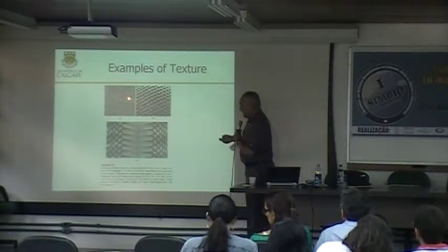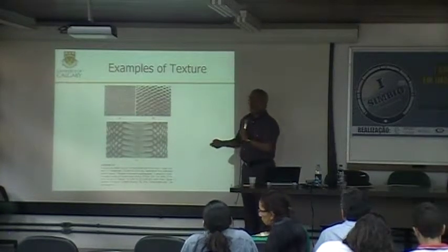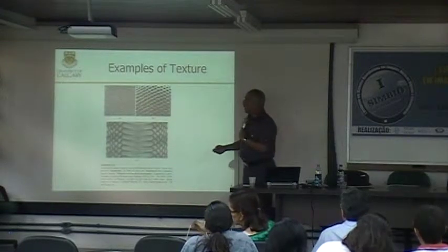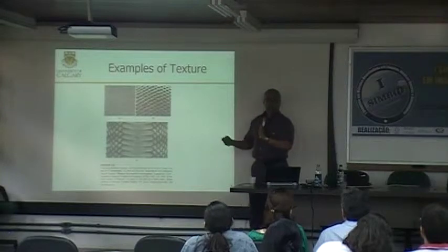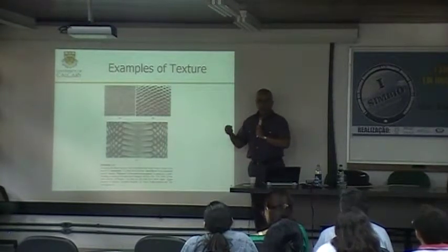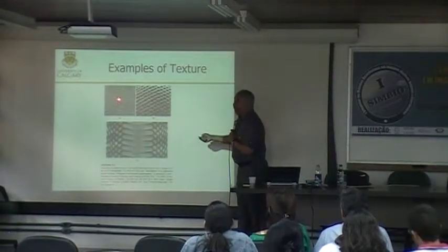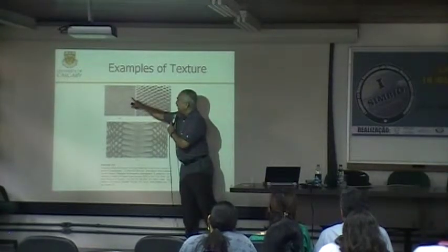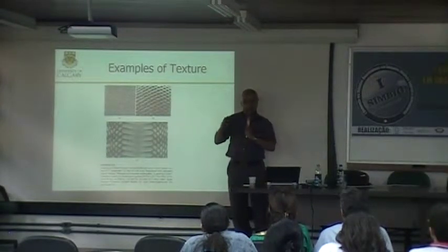This is an image of endothelial cells in the cornea. So these are almost hexagonal patterns, like a beehive. So what kind of a texture is that? It is ordered or regular or almost periodic texture. The same kind of pattern repeats. But this is not equal to that. They're not the same. They're not perfect hexagons, but almost hexagon.